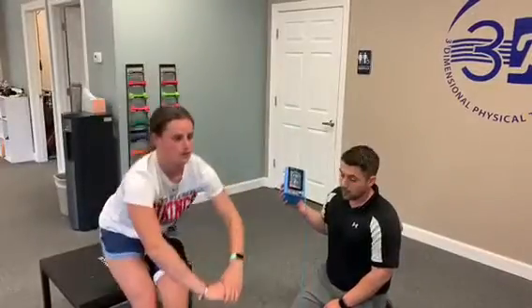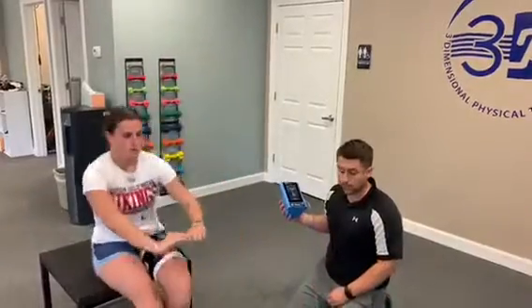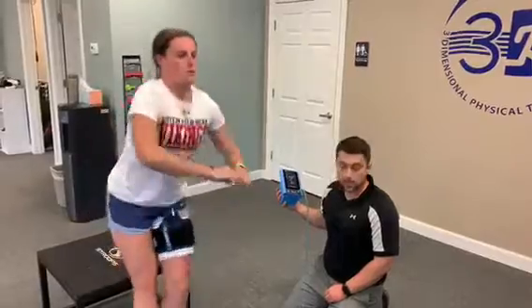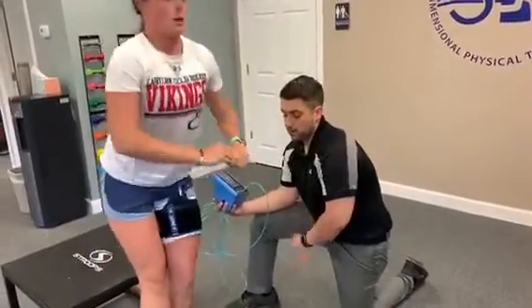By keeping the cuff occluded, we're trapping the lactic acid and other breakdown products in the muscle in that area, starting to cause the reaction we're looking for to make those strength and muscle size gains. Here we are on the last set of 15 of her single leg squats.